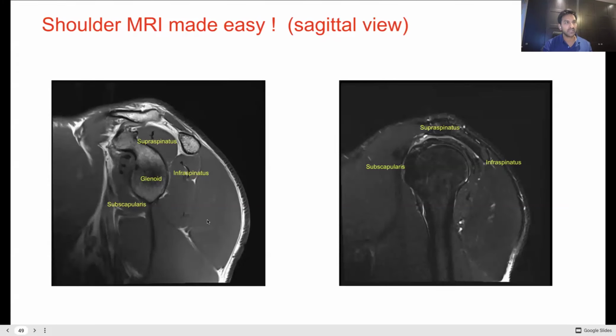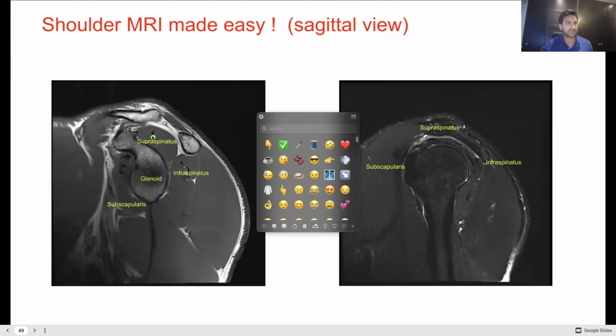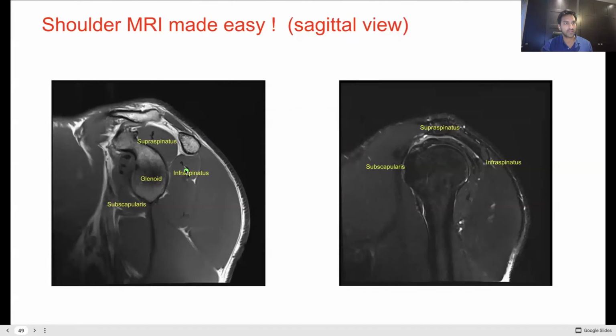Now, this over here is your side view. You're going from the side. So it's like the Roman helmet, sagittal view. So we're looking at this patient from the side and we can see the muscle bulk that's sitting here, the muscle bulk that's sitting here, and the muscle bulk that's sitting here. But as you start coming outwards towards the outside of the body, these muscles have got these tendons that are sitting right in the middle.